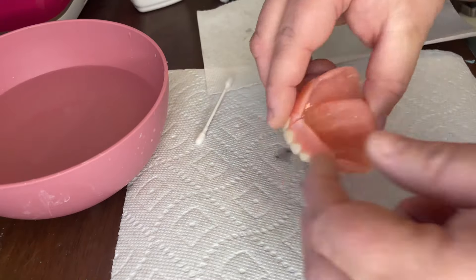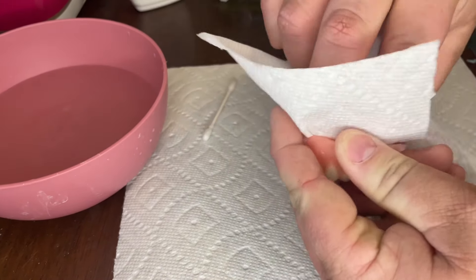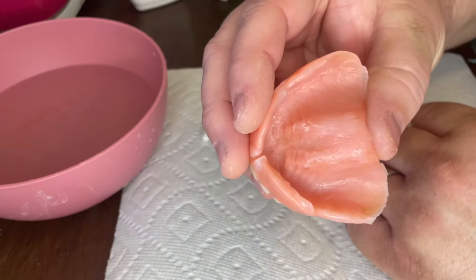I've been using them for a while, but it took me a while to figure out the proper method to apply the denture adhesive. So clean your denture and then dry it off thoroughly. You want to make sure your denture is completely dry or the adhesive will not stick to it properly.